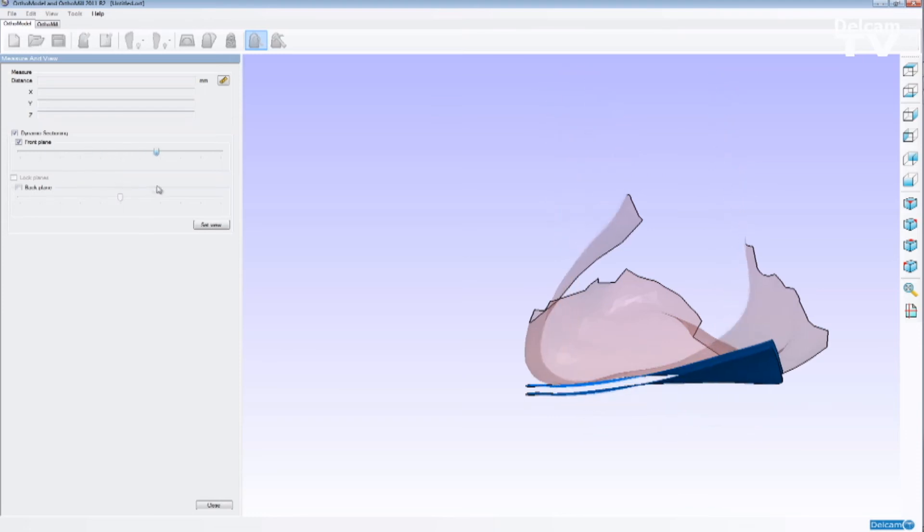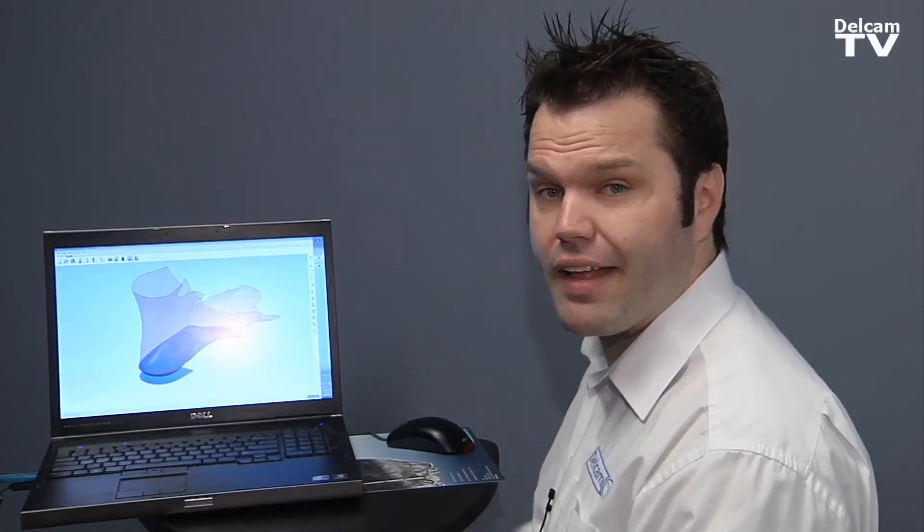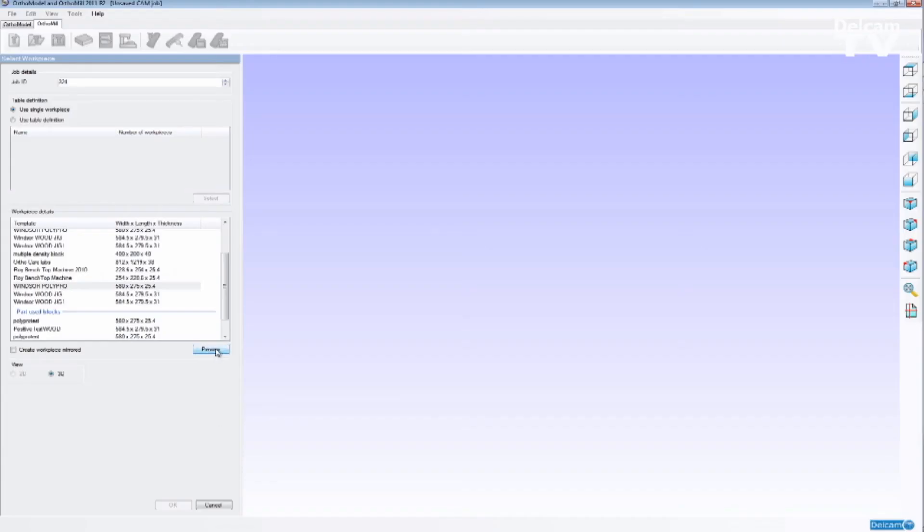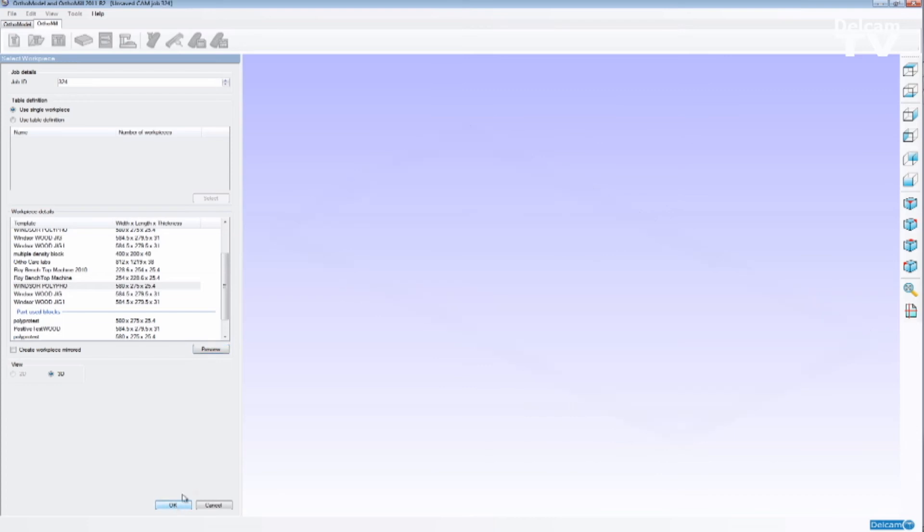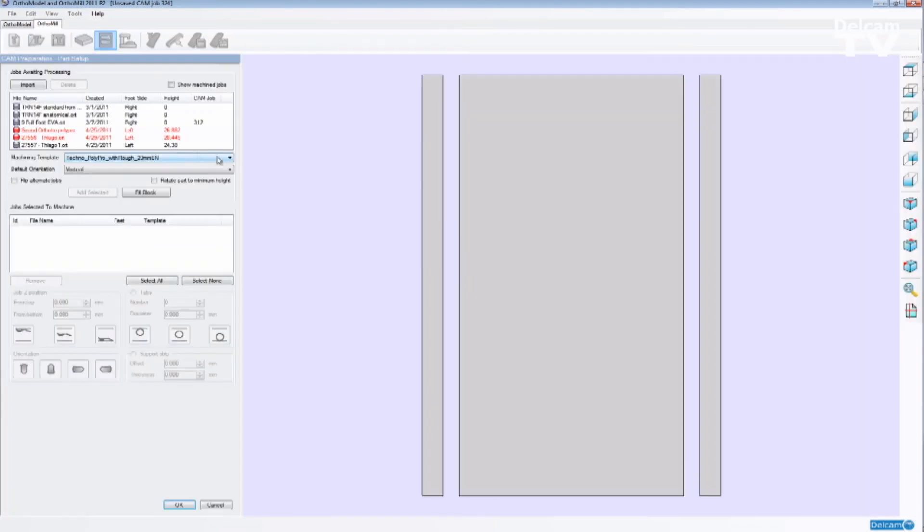Once we have finished designing the orthotic and we're happy with the design, we can then move on to OrthoMill to prepare for manufacturing. I'm able to select the material that I'm going to use to cut the orthotics and also the sizes as well. So I'm going to select one of the blocks that I have on my library.